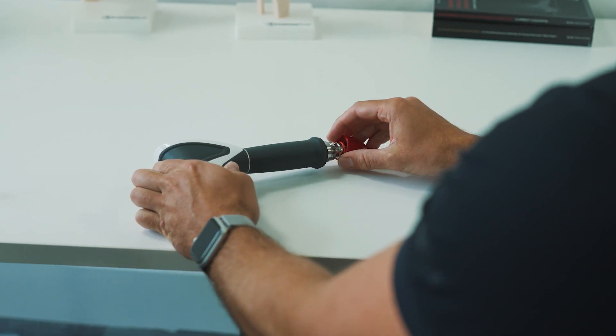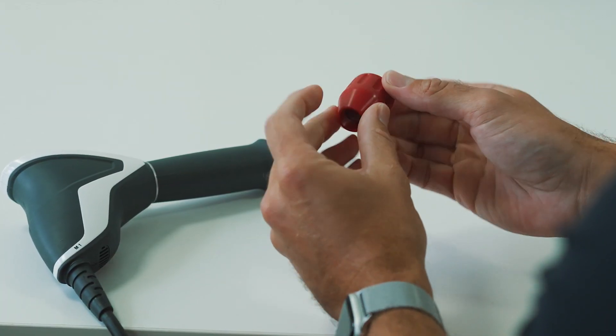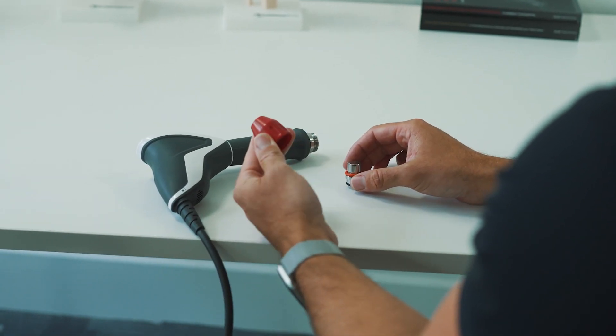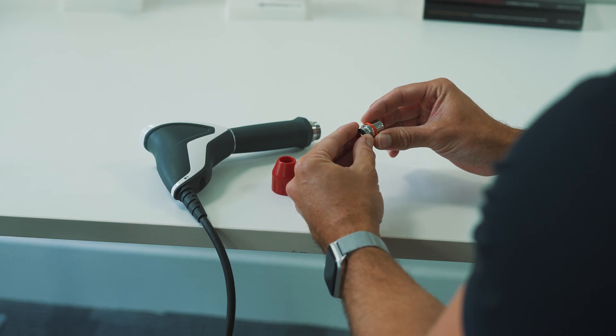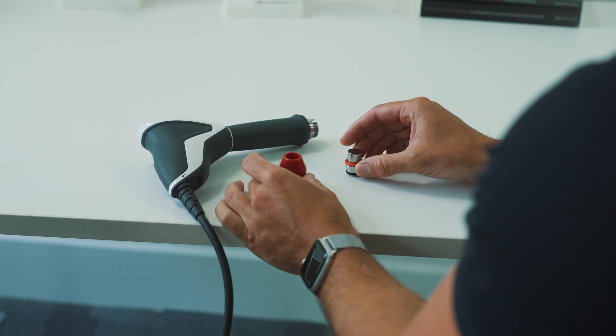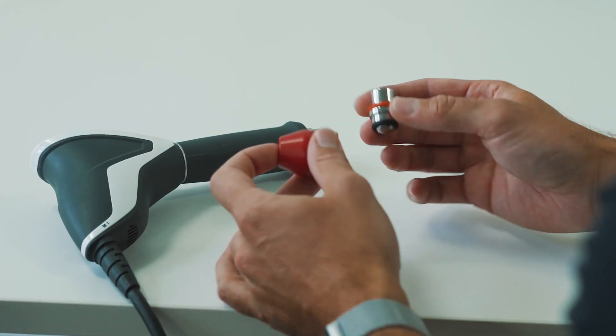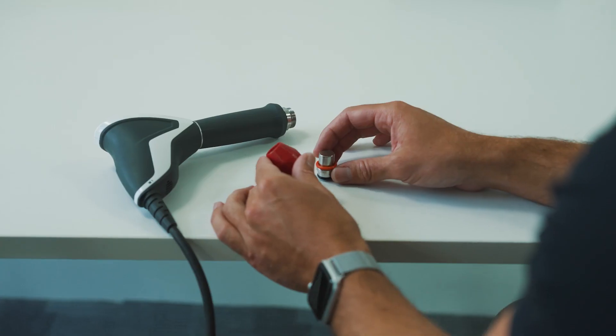To do so, ensure the device is turned off. Unscrew the transmitter and you'll notice that it will come apart into two pieces: your plastic shell and the metal part of the transmitter. To clean your transmitter you can use an ultrasonic cleaning bath, you can run these parts under cold water, or you can use an alcohol wipe.